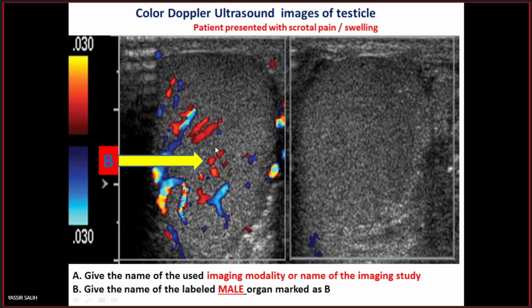If the question is, give the name of the imaging modality, what will be your answer? Imaging modality. Ultrasound. If the question is about the imaging study or imaging examination, color Doppler of the scrotum or testis.